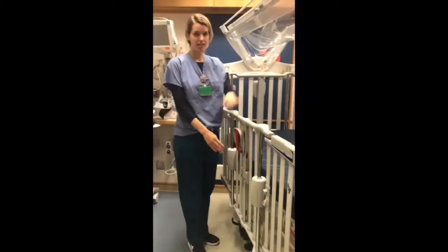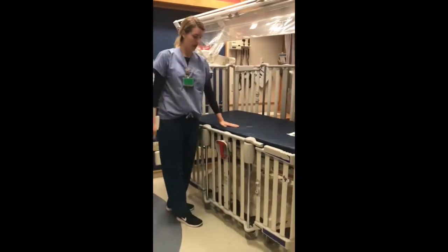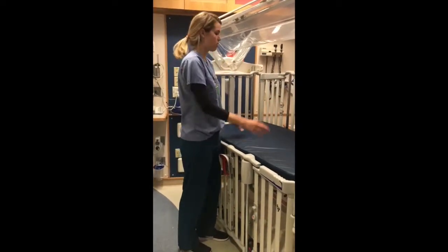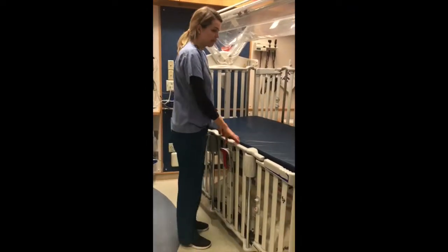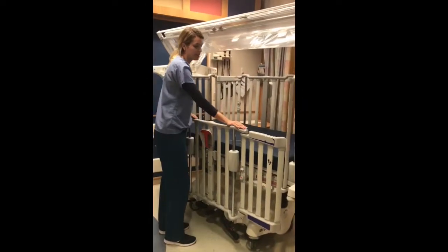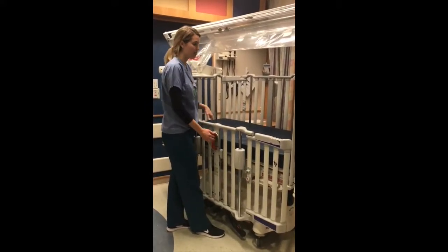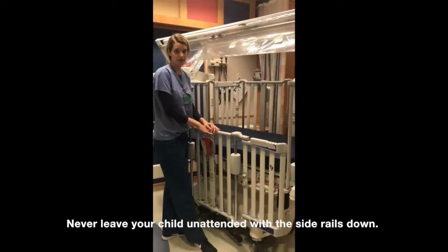There are three options for heights of the side rail in the locked position. At its lowest point, the side rail will be below or at mattress level. This will allow you easy access to your child for changing their diaper or accessing them in general if you want to take them out of the crib. We would recommend maintaining the side rail at least at some upright position while your child is in the crib for extra safety. While the side rail is down, you always want someone at the bedside to prevent them from falling out.